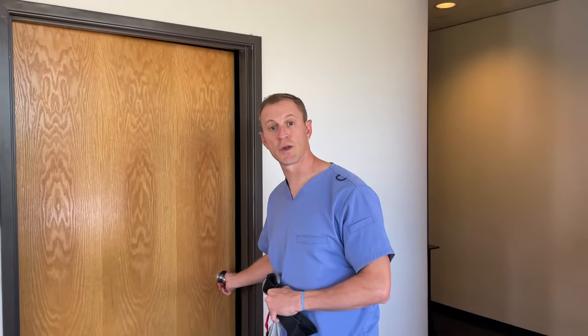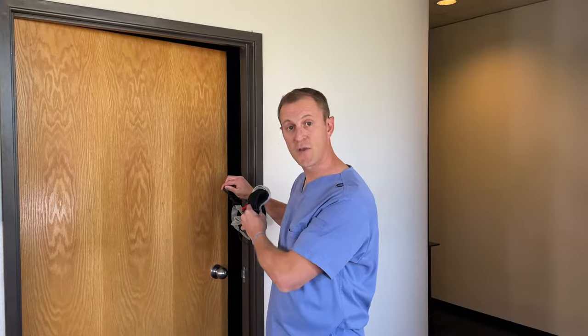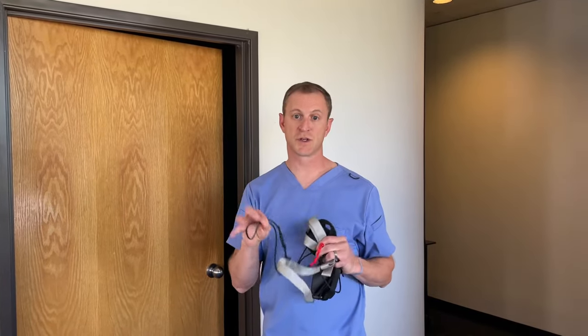The first thing you want to do is find a space where you can lay down on the floor in front of a door that closes by pulling it toward you. It is very important to secure your NeckEase in a door that you close by pulling towards you, so that as you increase tension on the cord, it only becomes more secure.